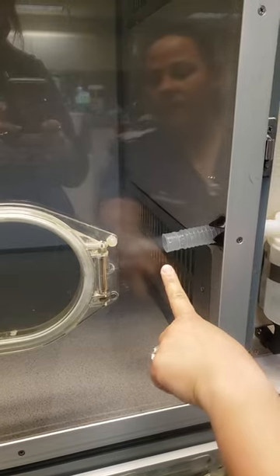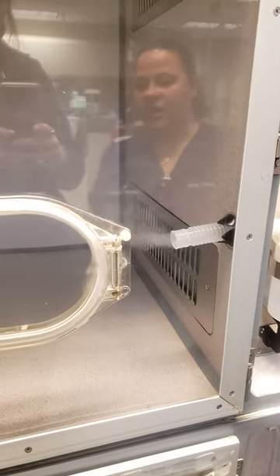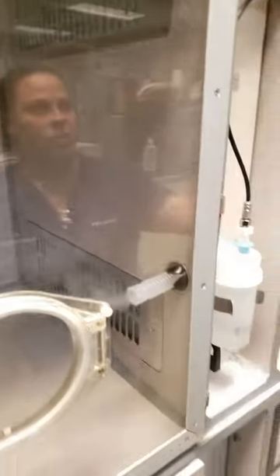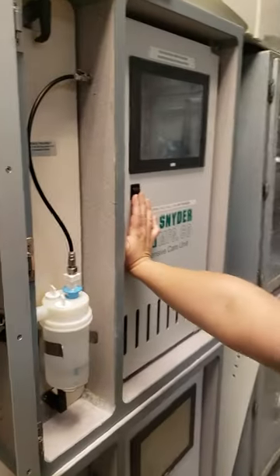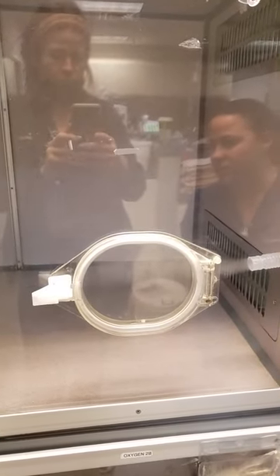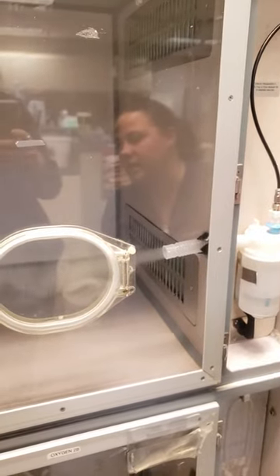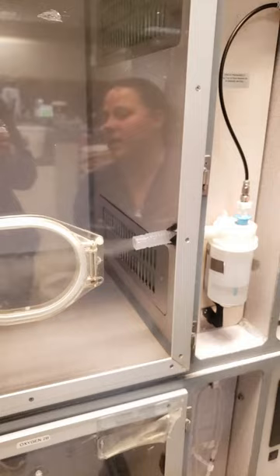You can hear it already starting and it's starting to kick out smoke. The problem is that if we leave it like this with the oxygen cage still on, you're sucking out your oxygen because your cage is circulating. So you're going to want to just turn your cage off, and then your cage will now fill — the direction of the smoke changed. Your oxygen cage will now fill with your nebulized saline and you're ready to nebulize your patient.